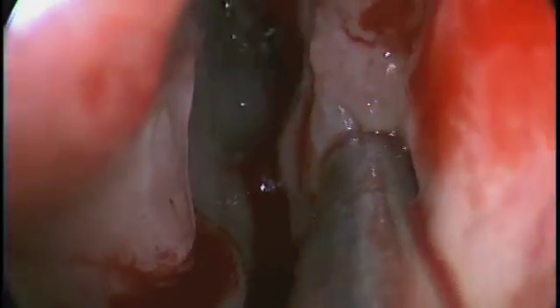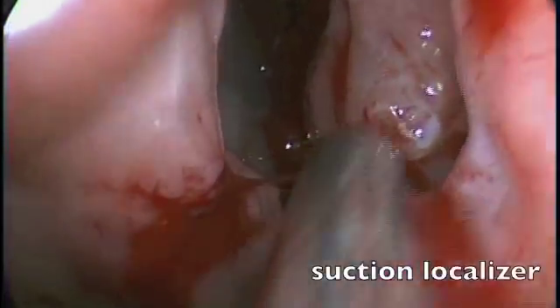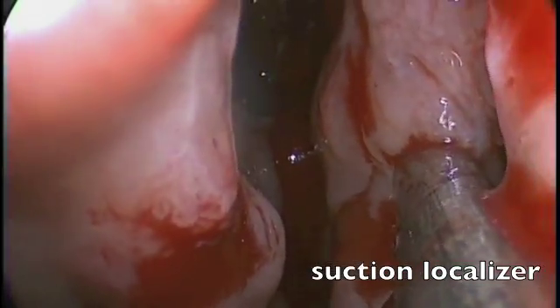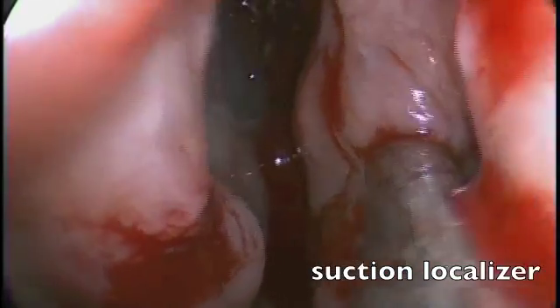The localizer is being used to help identify the structures. There's actually a separate screen which we're looking at which shows us where we are on the CT scan.